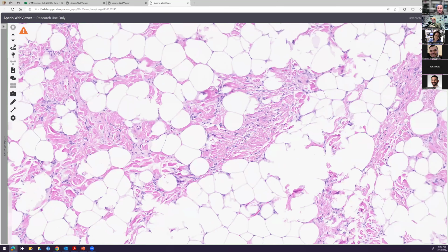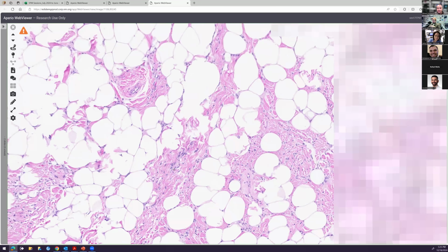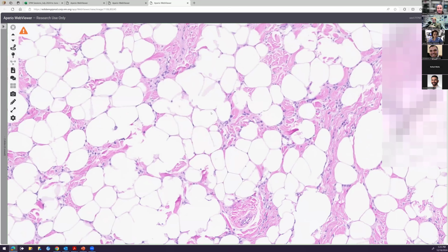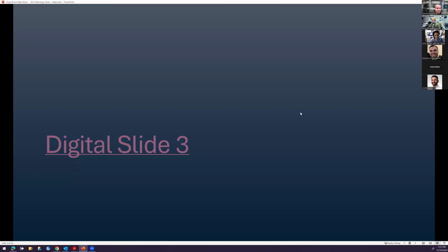In some of these tumors, you may also see some scattered giant cells as well. And the reason for that is that spindle cell lipomas are also kind of the same thing as what's called pleomorphic lipoma. So the two exist in the same spectrum. You just may see more scattered giant cells in pleomorphic lipoma. All right, great job.